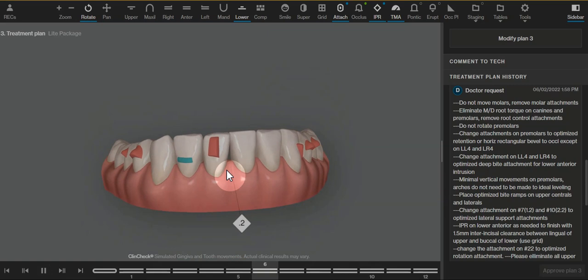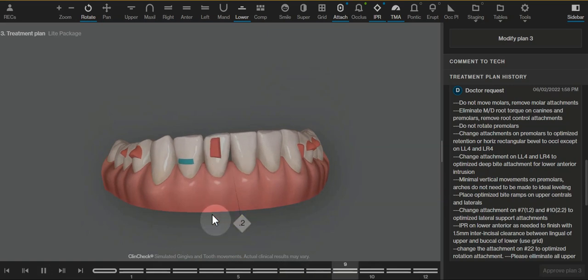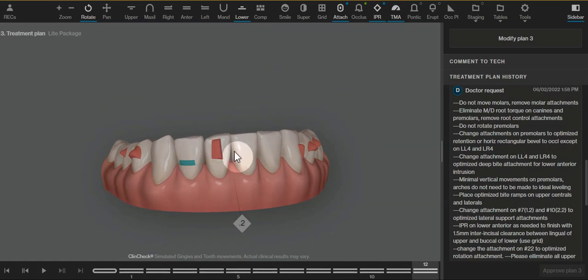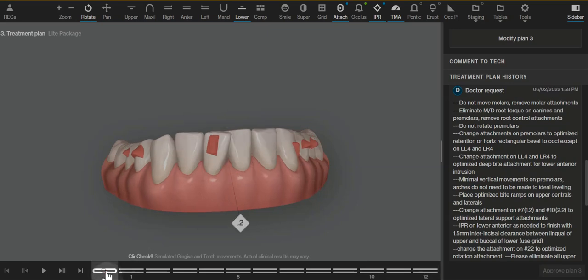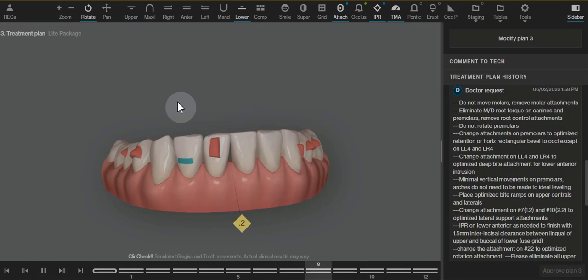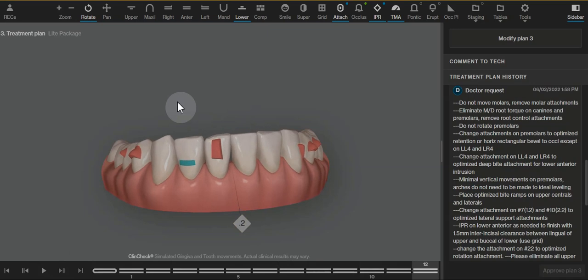We need additional attachment to help with that mesiodistal type movement. We could go without that movement and go without an attachment. We would then likely need to do more IPR to compensate for the black triangle. The reason for the conventional attachment is that there is not an optimized attachment designed for this type of movement for lower anterior incisors.